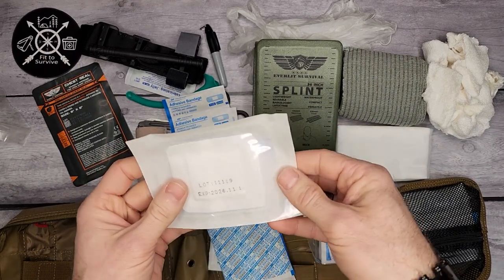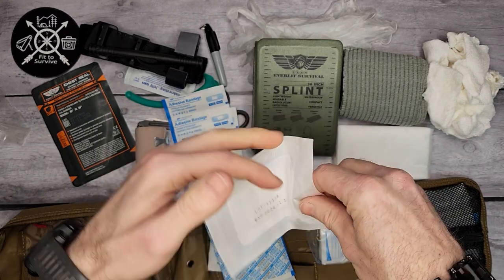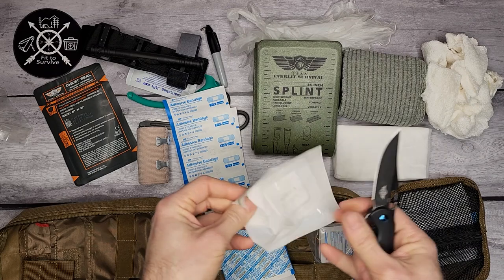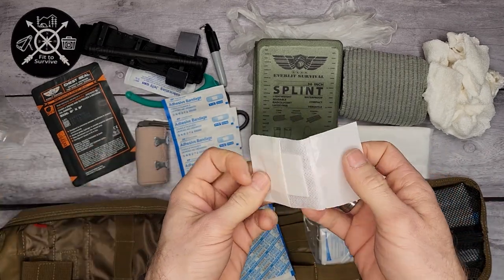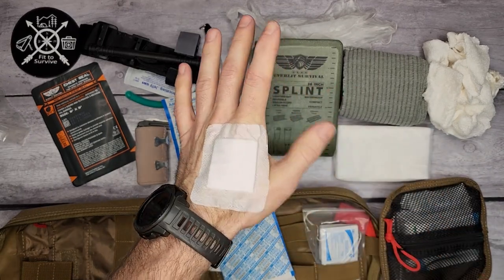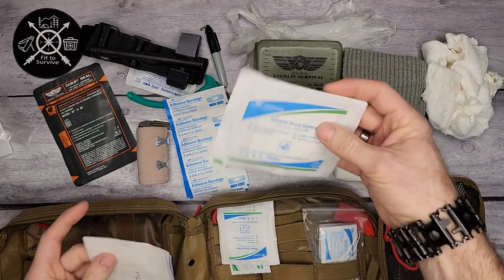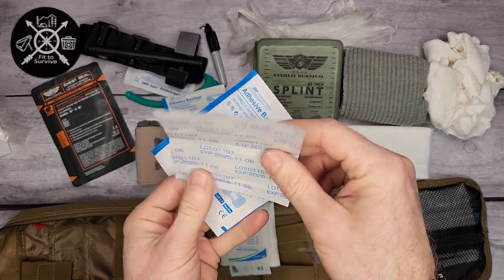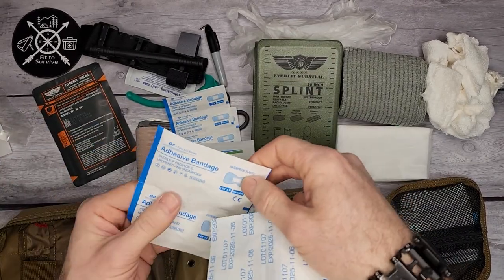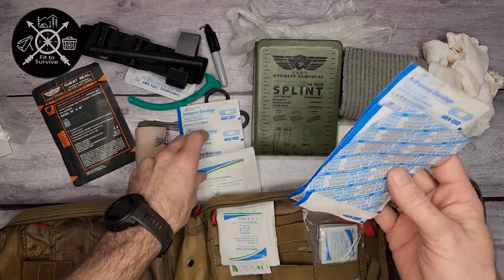Then you have an adhesive wound dressing for smaller wounds — it has its own sticky pad around it, so it stays right where it's supposed to without needing any tape. There are two of those. There are also knuckle band-aids and some other different-shaped band-aids. All three are band-aids, just different shapes depending on where you're applying them.